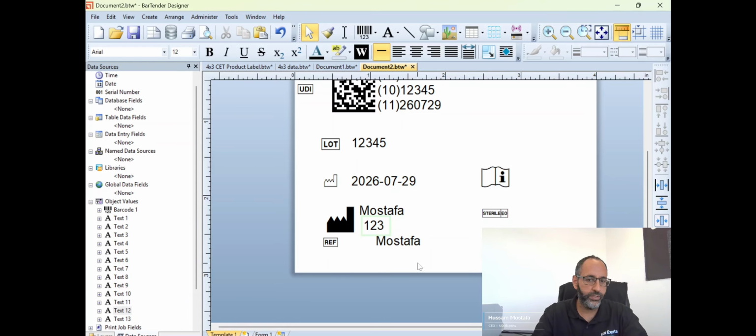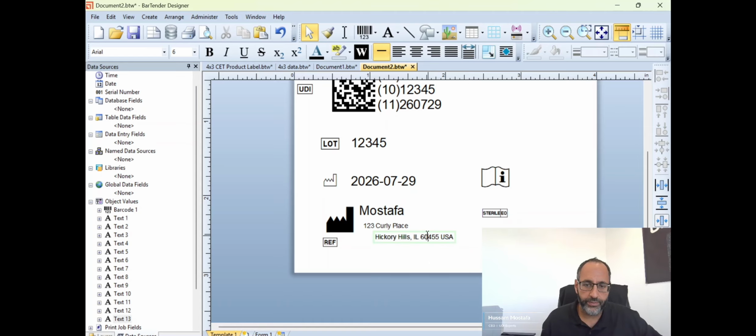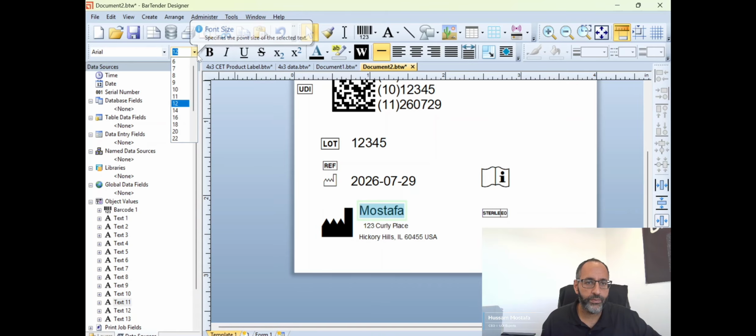Address, you just say 123 Curly Place. And make it smaller. Then we could put in the city and the country. So just make this 6. Okay, and then we could say, for example, Hickory Hills, Illinois, zip code, matching the country. All right. Put this ref probably at the top over here. Make this bigger. Make this smaller. Okay. Line it up. Okay.